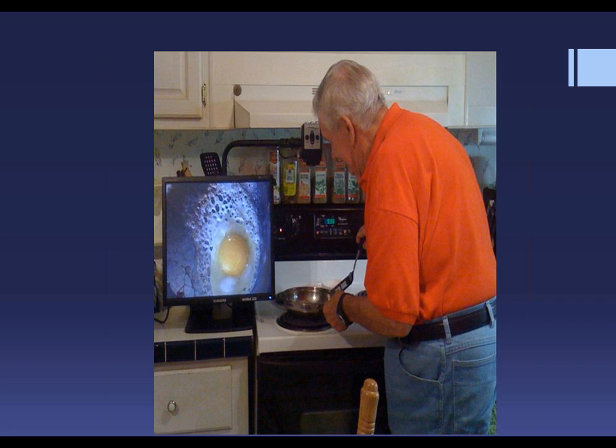This is a successful morning in the kitchen because this egg is looking pretty good. I have chosen the Acrobat for this section. There are other devices available through Enhanced Vision, but this particular device is my personal favorite for the kitchen.